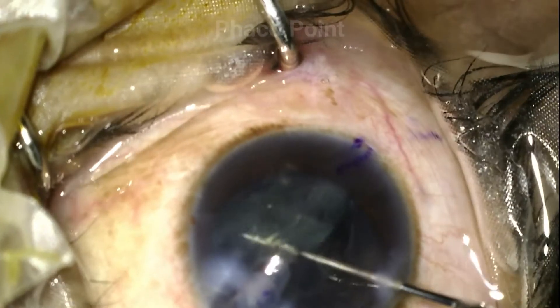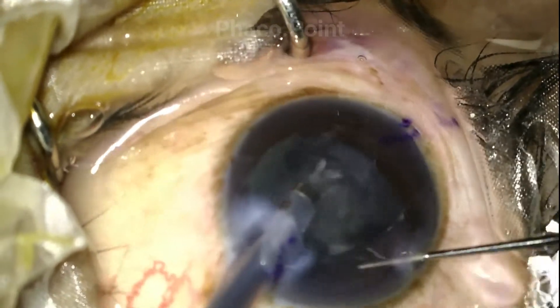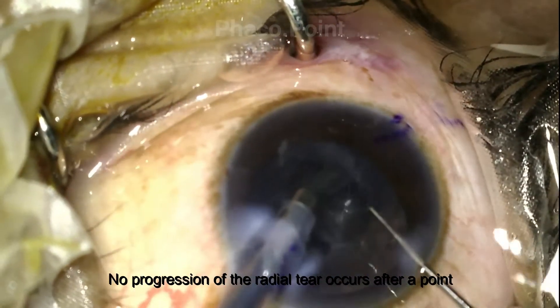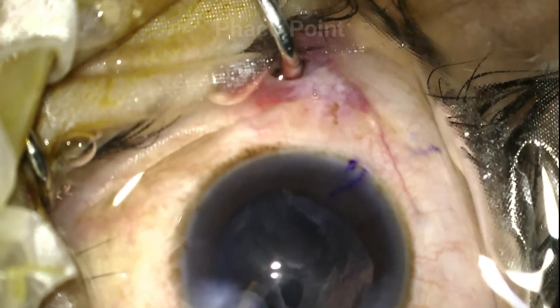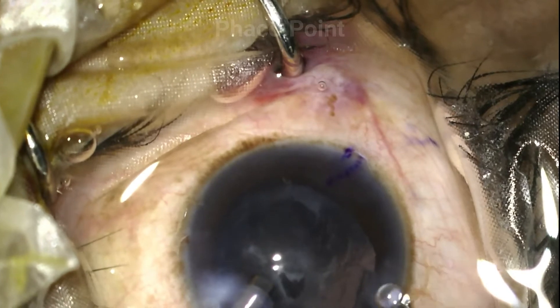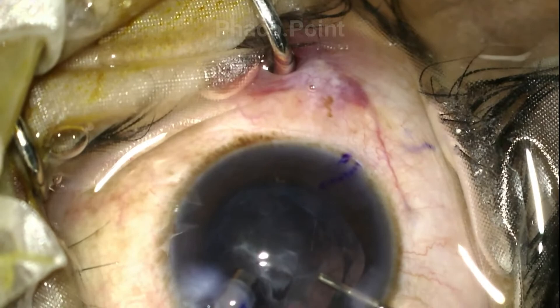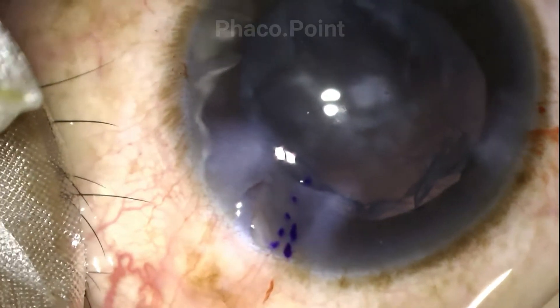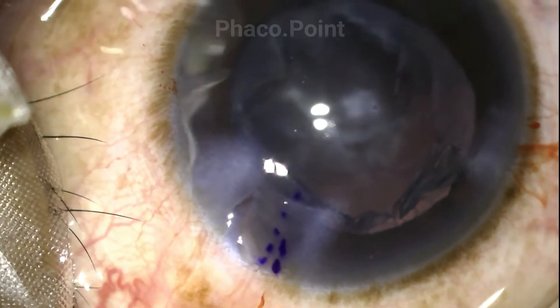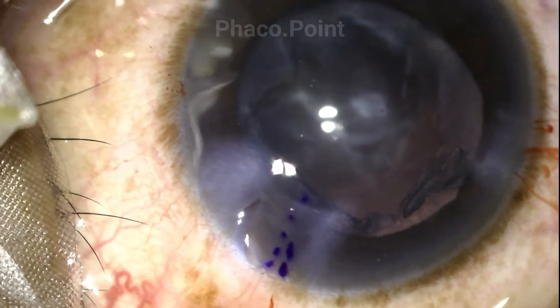Now at this point we get almost to the end of the FACO. This is just the epinucleus now being removed and the tear in the wound remains static. Before we proceed to irrigation aspiration, the surgeon performs a visco fluid exchange — remember, this is a polar cataract. Please note what the wound looks like. This is the high-magnified view of the radial tear in the main incision. What caused it? One doesn't know. Why it did not proceed? One doesn't know.